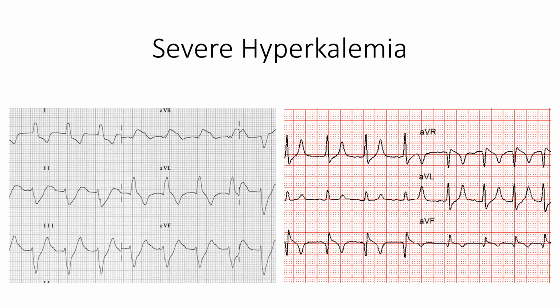Now, what's interesting about hyperkalemia is early on you develop T-wave changes, but when you start to get really, really high potassiums, that is not a linear progression. I do see some blogs and some textbooks that talk about correlating an ECG with potassium levels, and there's some correlation, but the human body is adaptable, and any patient who's developed hyperkalemia in the past is by default more likely to become a little bit more resilient.